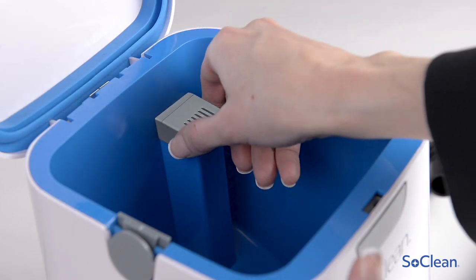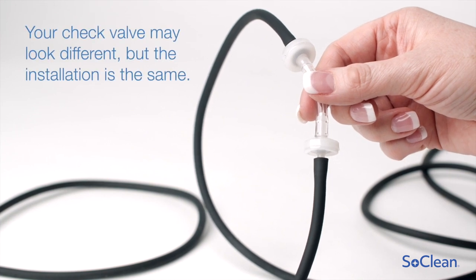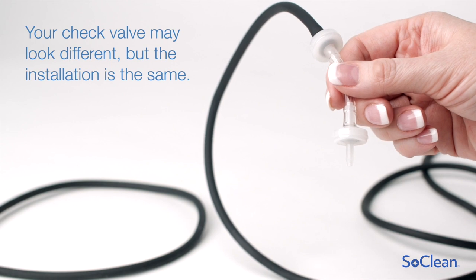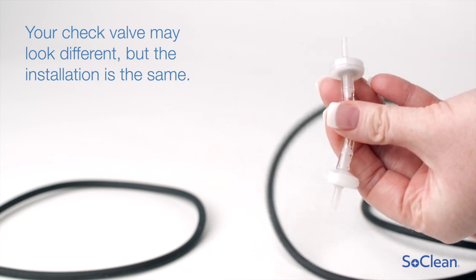Place the new filter into the SoClean. Grasp the barrel of your current check valve firmly and pull the tubing away. It may be necessary to use a twisting motion. Repeat to disconnect the tubing from the other side.